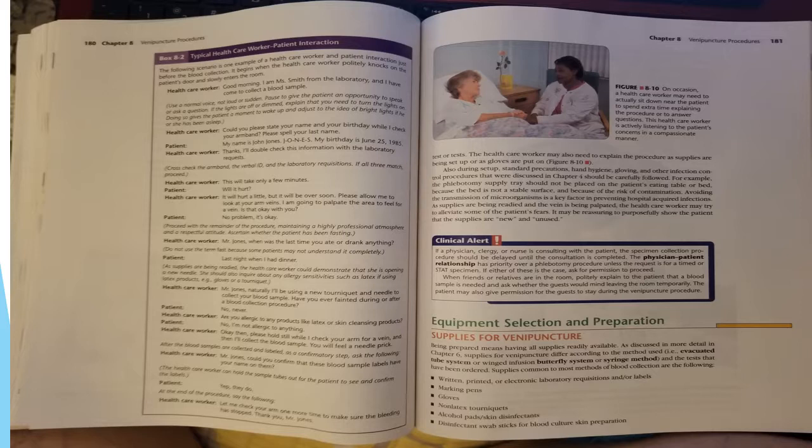Avoiding the transmission of microorganisms is a key factor in preventing hospital-acquired infections. As supplies are being readied and the vein is being palpated, the healthcare worker may try to alleviate some of the patient's fears. It may be reassuring to purposely show the patient that the supplies are new and unused.